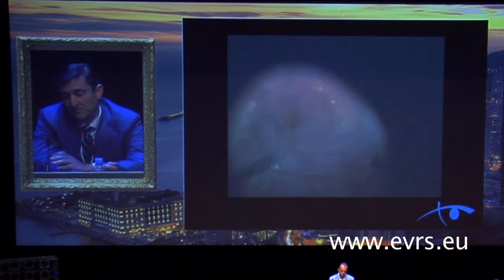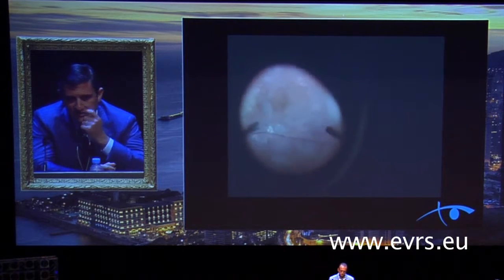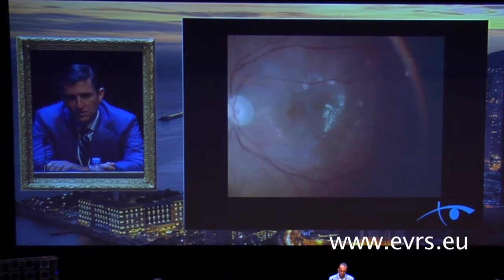And you can already see after some of that's being washed out that the retinal whitening is starting to go away as it's replaced by more isotonic infusion fluid, and you sort of get a little bit of a restoration. And when we originally did this, we didn't know what the effect was going to be. Is it going to affect the anatomy short-term or long-term? Is it going to lead to any functional benefit to the patient? We did the initial OCT angiography to look at perfusion around the macula to make sure that there were some good vessels in the macula that might allow for this to be effective.